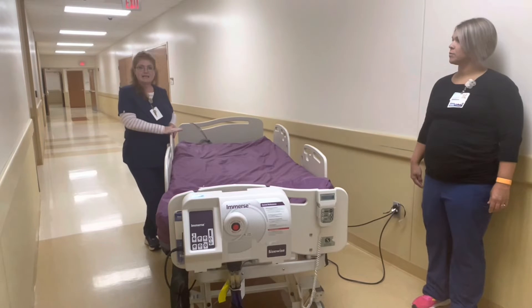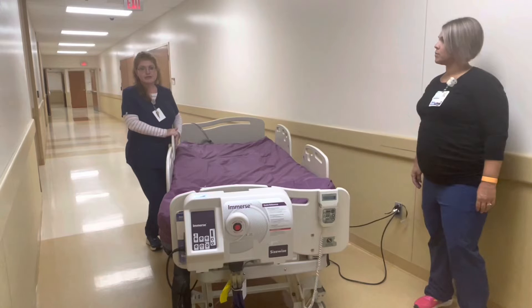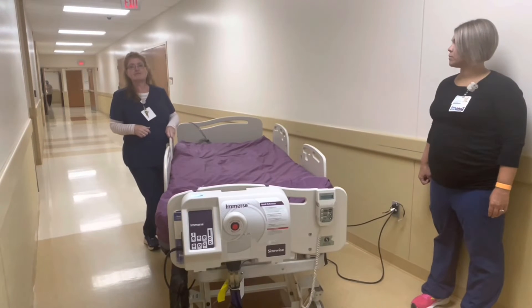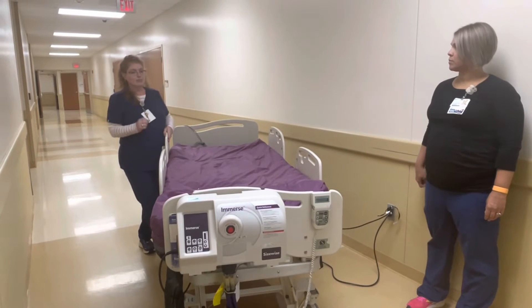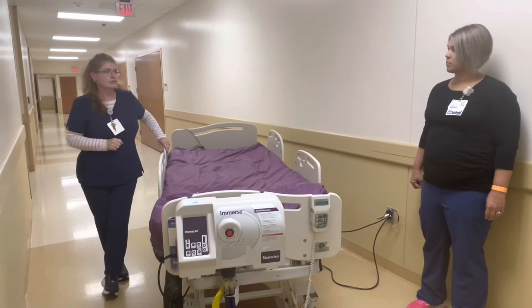Four rails up is not considered a restraint on these surfaces — this is a safety feature. There is a carve-out in the restraint requirements for these types of beds. So we always always want to have four rails up on these surfaces when we have a patient on the bed. It is safety; it's not considered a restraint.